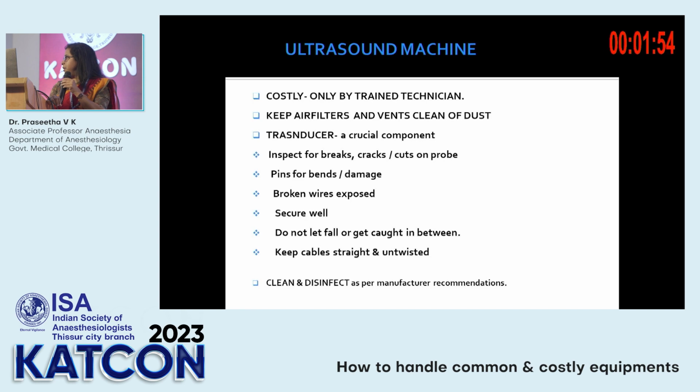Secure the probes well, and do not let the probes fall or get caught in between your OT table, your arm boards, etc., while you are doing your blocks. And whenever you use the probe cables, keep them straight and untwisted. And always clean and disinfect all this equipment as per the manufacturer's recommendation.